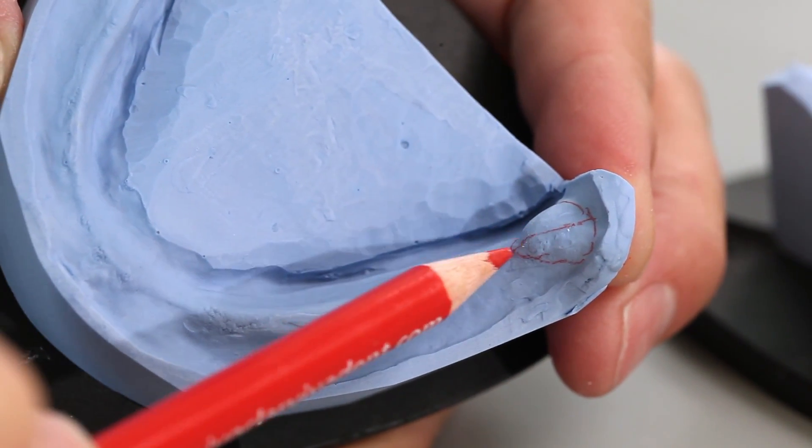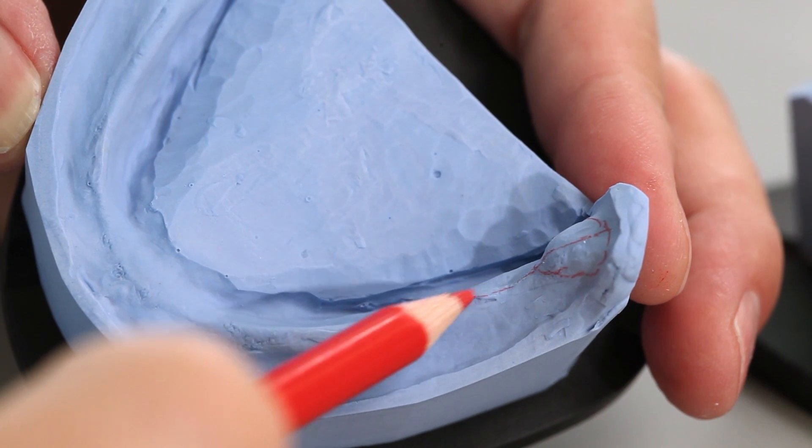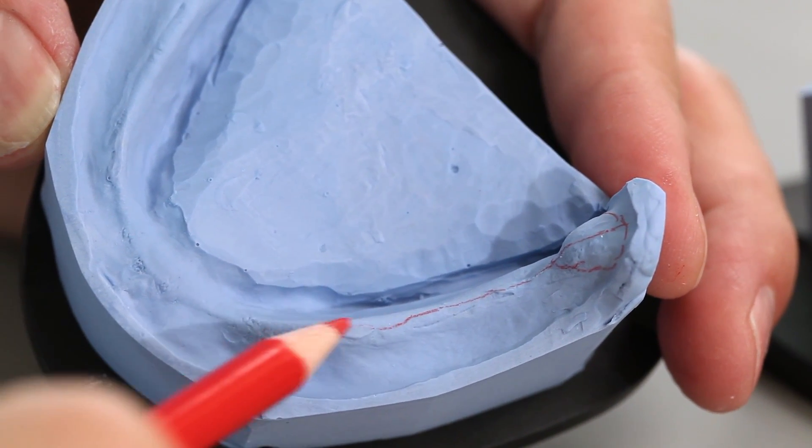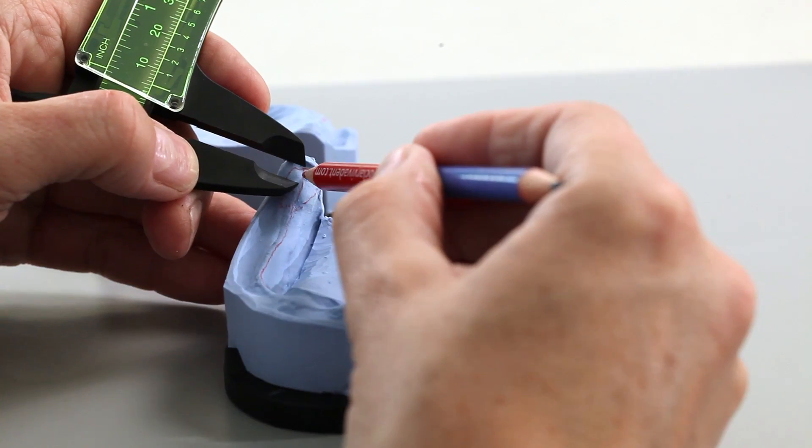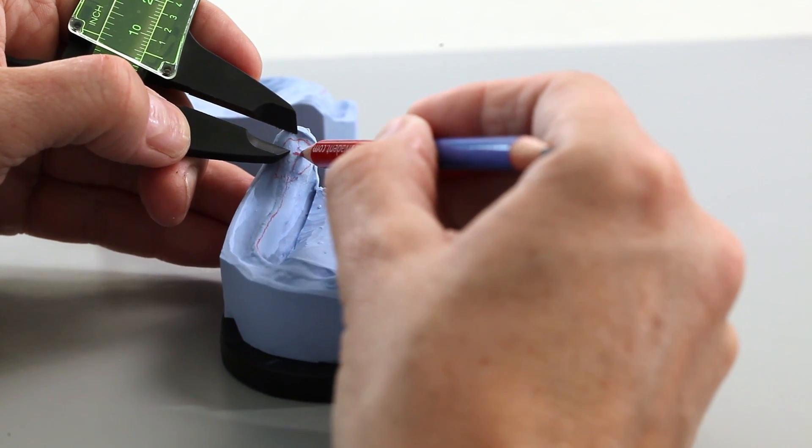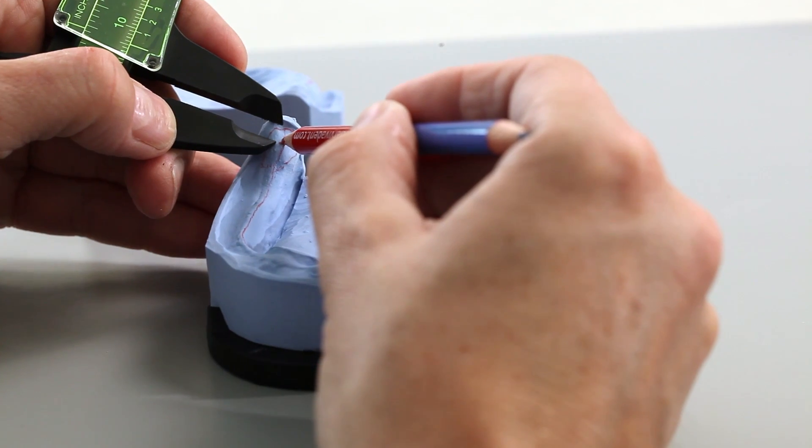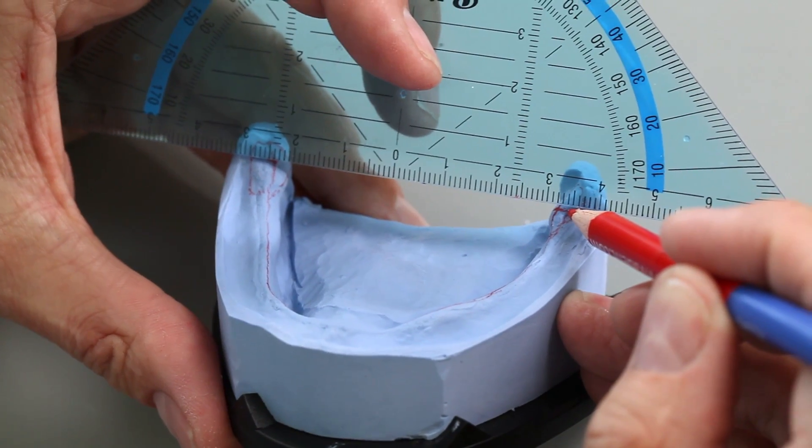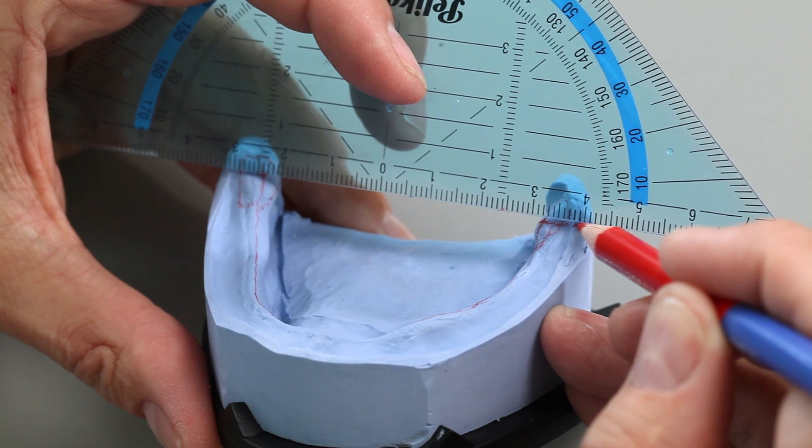In the lower jaw, mark the retromolar pad and the path of the alveolar ridge. Mark the occlusal plane in the area approximately 5mm below the dorsal end of the retromolar pad. Transfer it to the model edge.